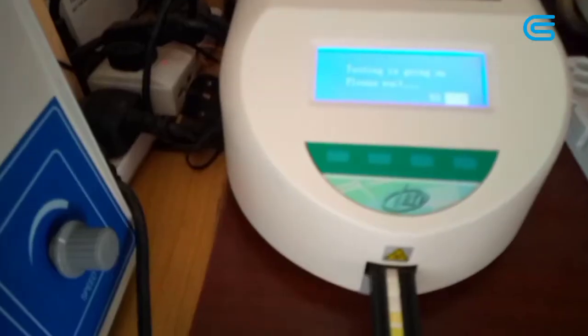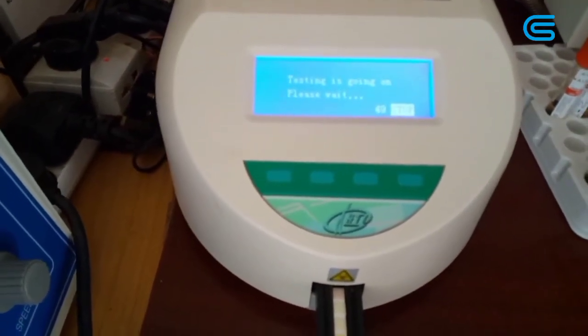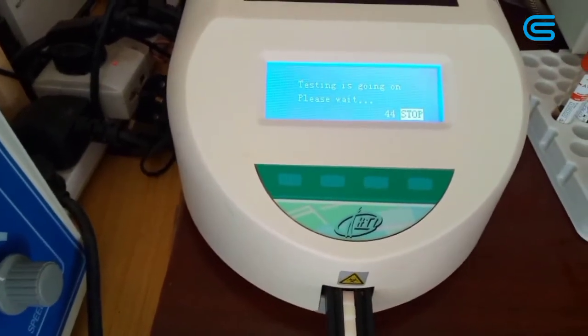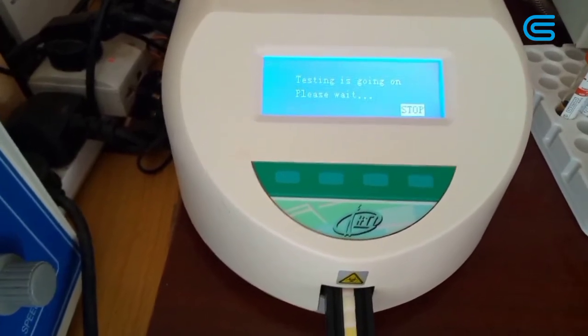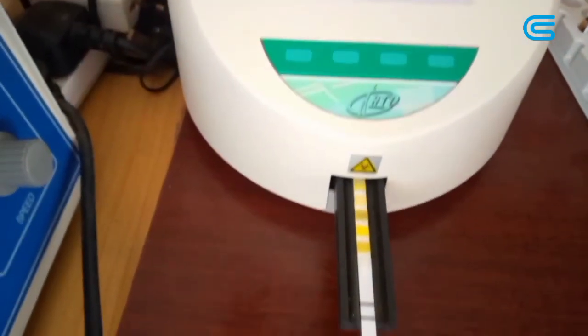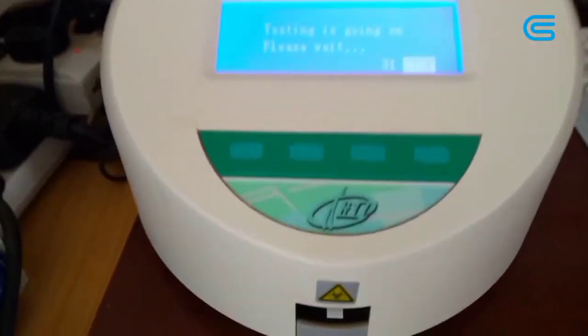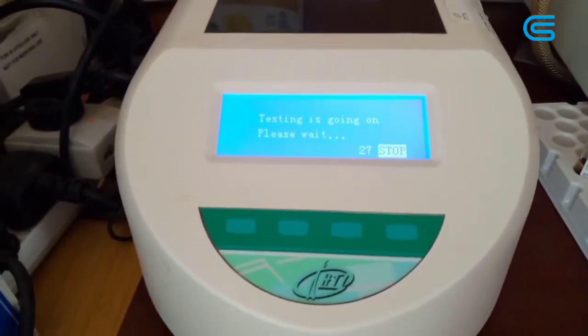Then you dip the stick in a urine sample, and the specific parameters react to produce a color that is compared to the severity of the component that is present. The entire strip is dipped in the urine sample, and color changes are sequentially observed and compared to a predetermined chart.